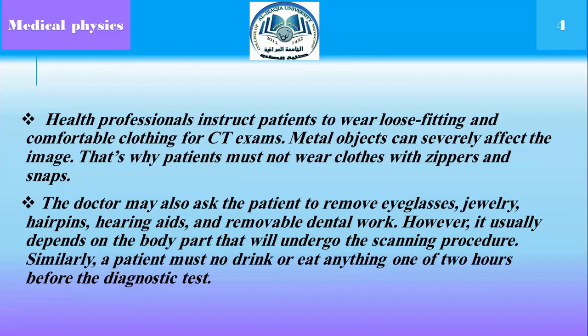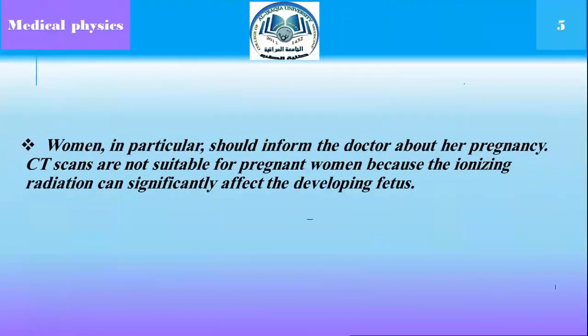Similarly, a patient must not drink or eat anything 1 or 2 hours before the diagnostic test. Women, in particular, should inform the doctor about her pregnancy. CT scans are not suitable for pregnant women because the ionizing radiation can significantly affect the developing fetus.